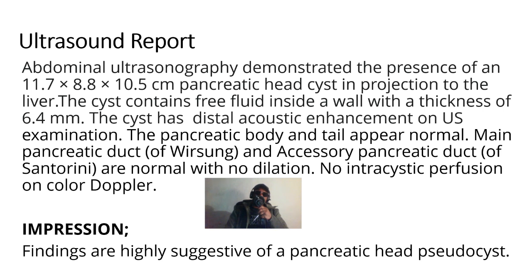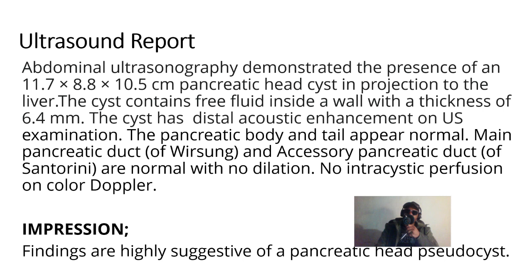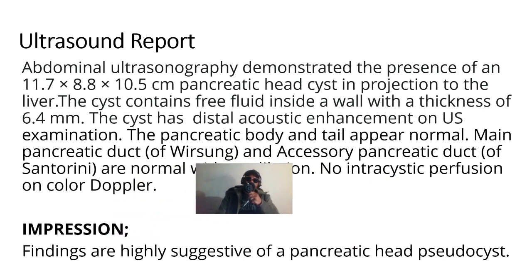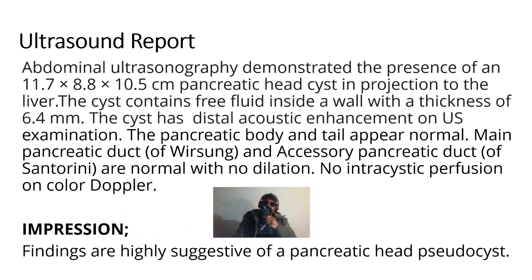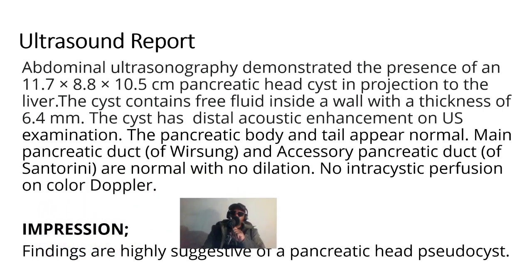When you're writing a comment, by any means try to avoid prescriptive reporting or diagnosis where you just say this is. That can be dangerous in case of litigation. Make sure that you avoid making a very straightforward diagnosis. Instead, say: findings are highly suggestive of a pancreatic head pseudocyst. You see, I am not 100% saying that it's a pancreatic pseudocyst, but I am saying that findings are suggestive of. Meaning to say, it can be anything else. In the event of litigation, it means I have tried to avoid wording that can come back in future and hit me. So this is how you are supposed to craft your reports.